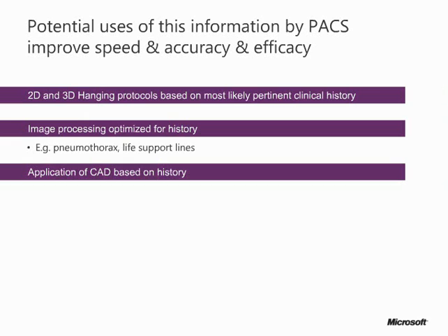And so if I could actually have these things with this automated resident or fellow and integrate them between my PACS system and put together or amalgamate all the different information, I think I would be a much more effective physician as far as not only productivity and efficiency, but also quality of patient care.